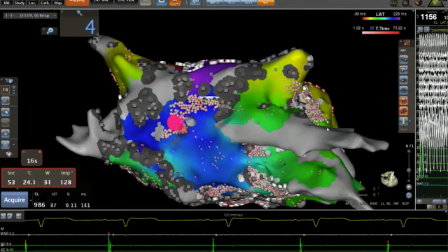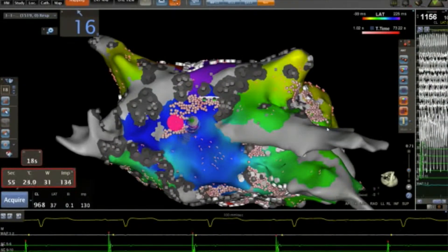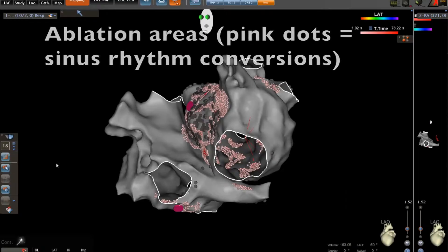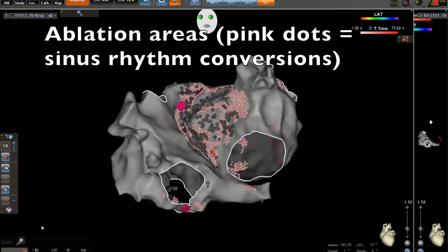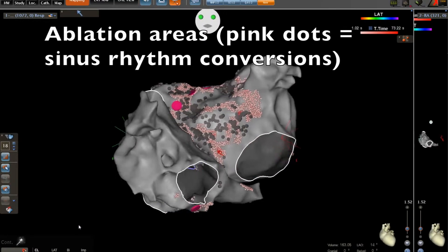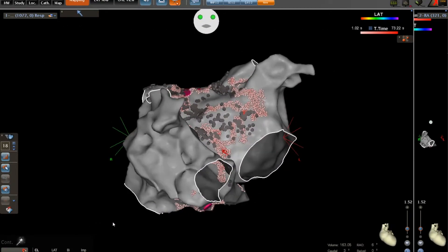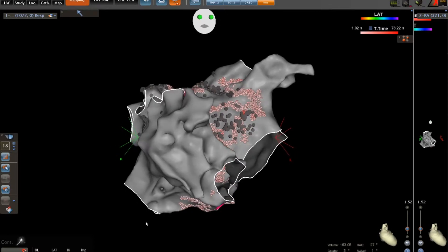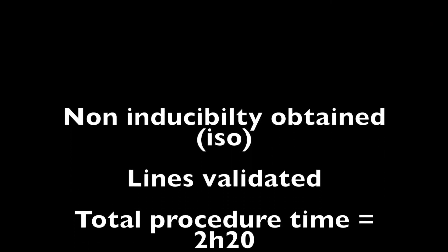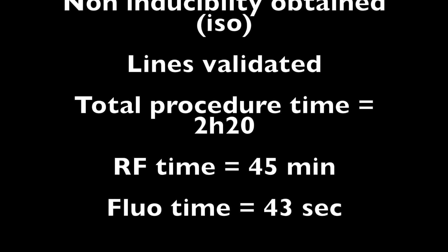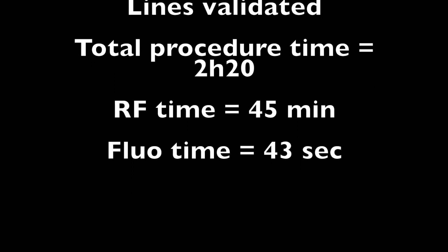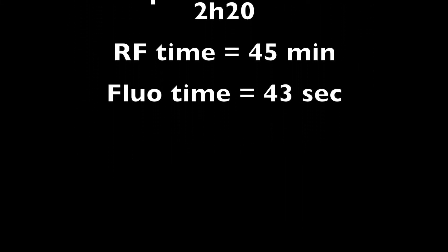Then no more atrial arrhythmias were inducible. You can see here the bi-atrial ablation map and the pink dots corresponding to the sinus rhythm conversion spots. The total procedure time was 2 hours and 20 minutes and the radiofrequency time was 45 minutes. Thank you very much for your attention.